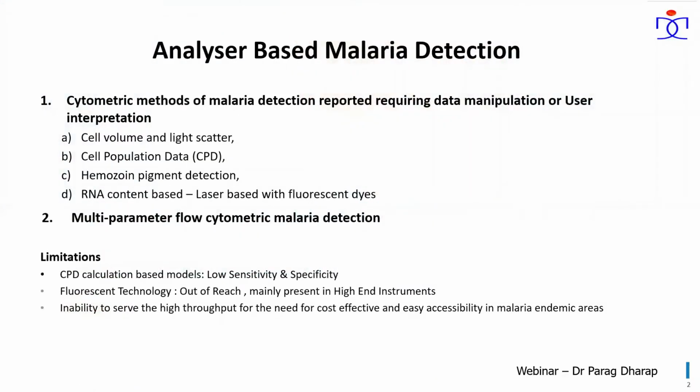Now, over centuries, scientists and researchers have been trying to unlock hidden potential of blood cell counting to diagnose, screen, and monitor various diseases as well as general status of a person. With advances in blood cell counting technology, we have not only been able to achieve accuracy and repeatability, but also been able to assess some qualitative attributes of individual cells.